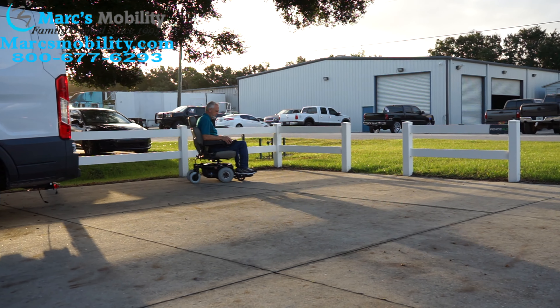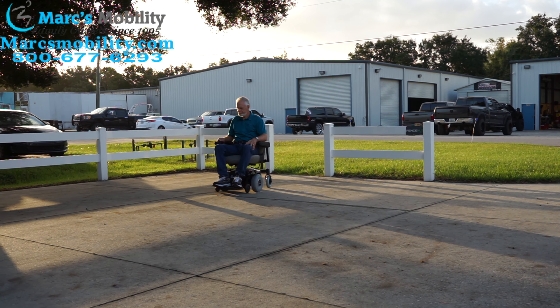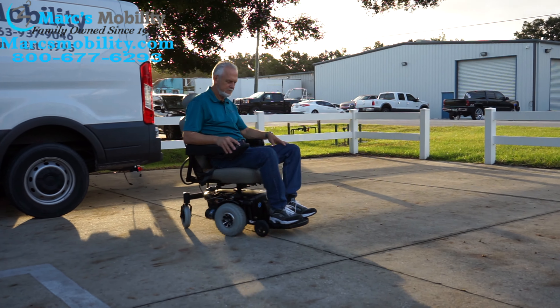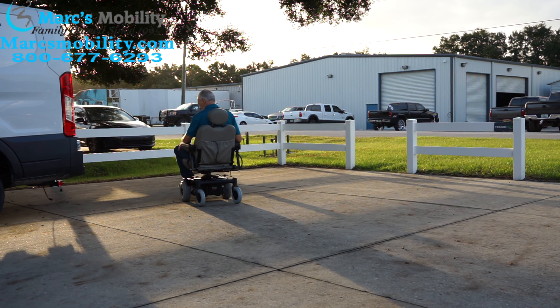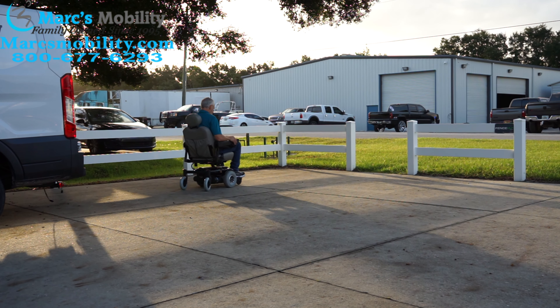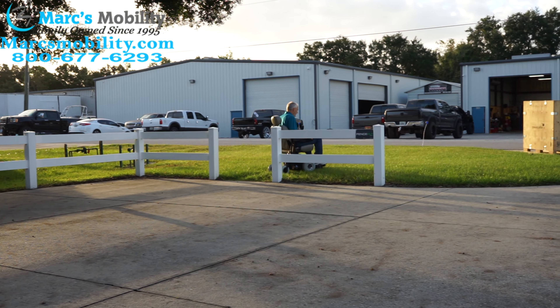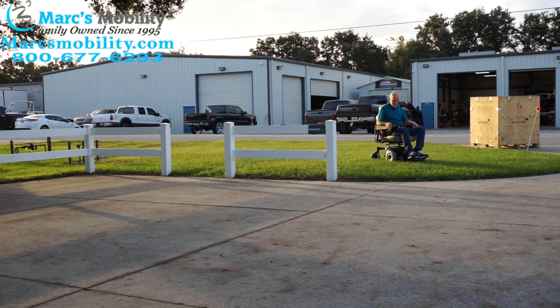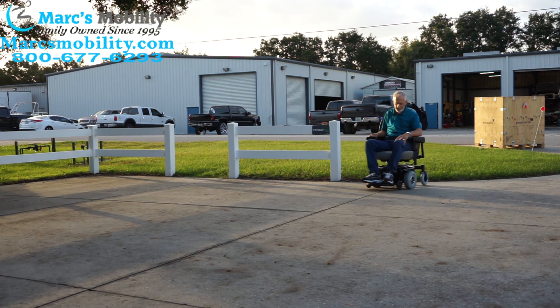Now we're bringing the seat back down. This chair has one of the nicest seats ever built by Pride Mobility. It's the old-style seat — super comfortable and very high quality.